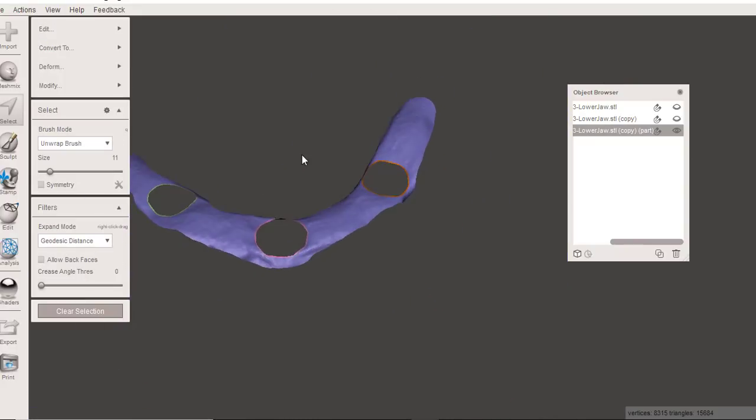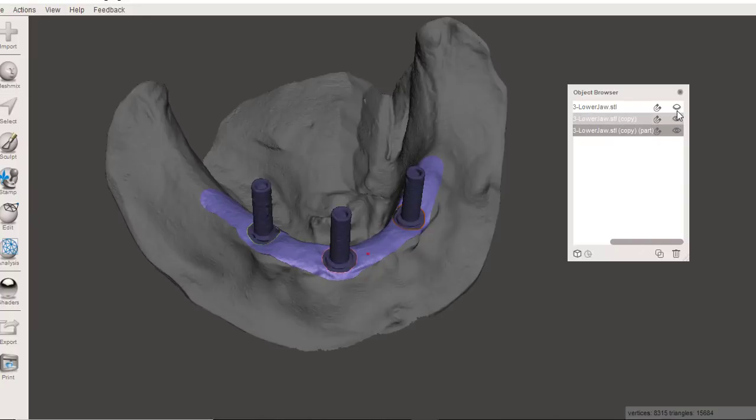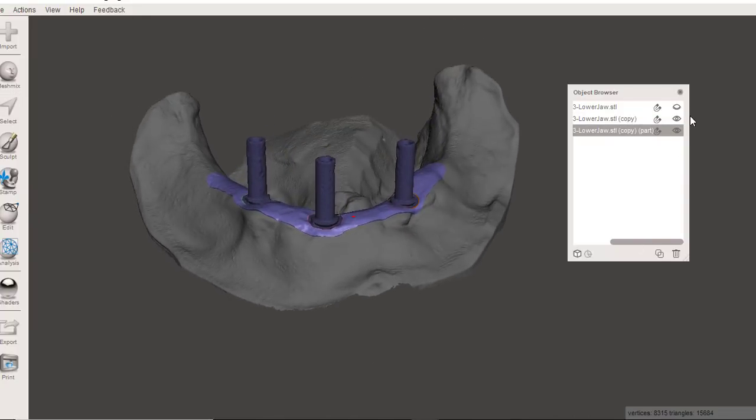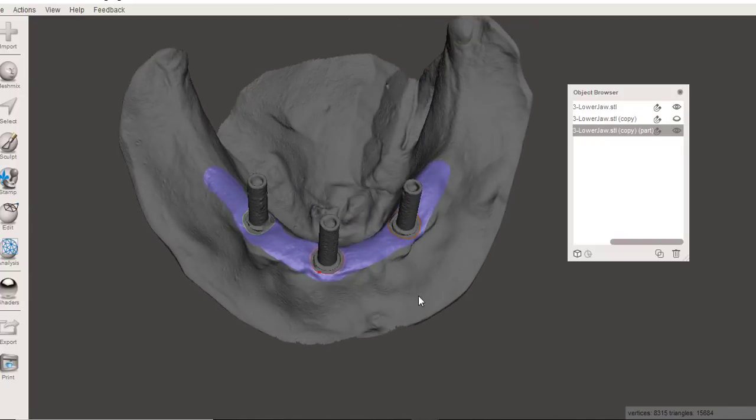And accept. So here we go. And now, if I was to turn on the original model, you can see how that is extruding through, or here's the original model, you can see it a little better. So with that done, let's now select all of this surface.